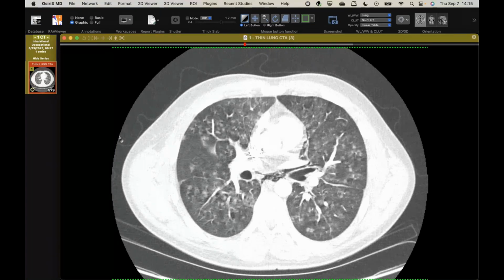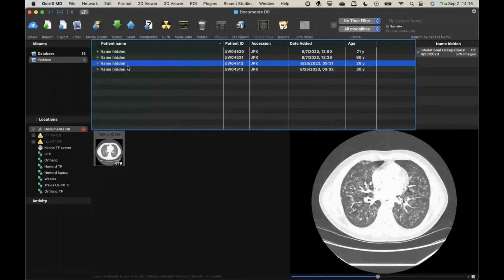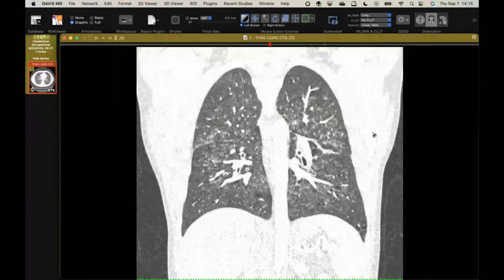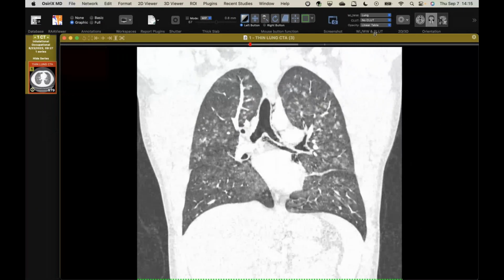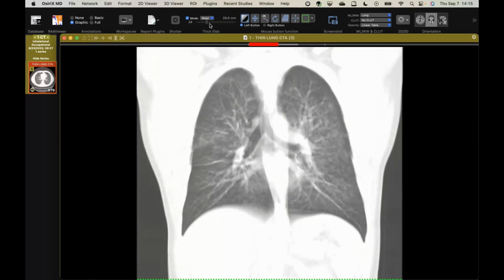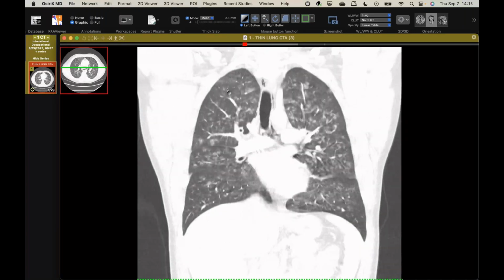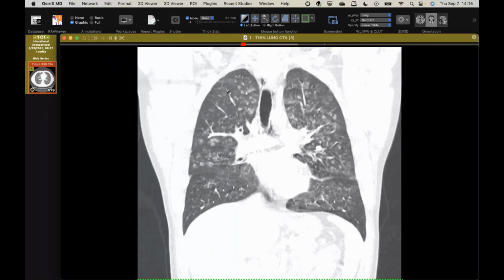It kind of reminded me of some of the vaping cases we saw that were more centrilobular, a form of organizing pneumonia, just centered more on the airways. History is very important. Yeah, this is upper lung predominant, which goes with most inhalational diseases. But the vaping cases you guys have shown in the past, those have often been mid and lower lung predominant, right? Mostly diffuse. The nodules usually were more mid to upper when there were discrete centrilobular nodules like this.